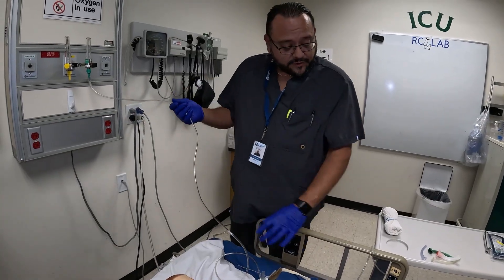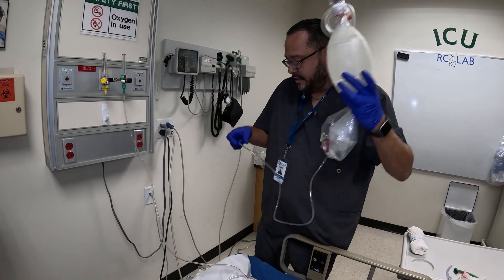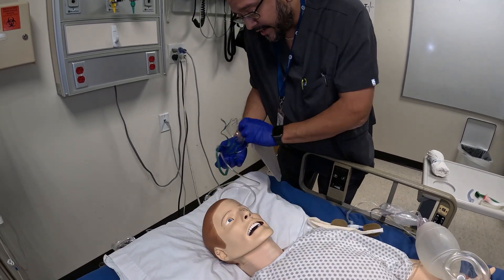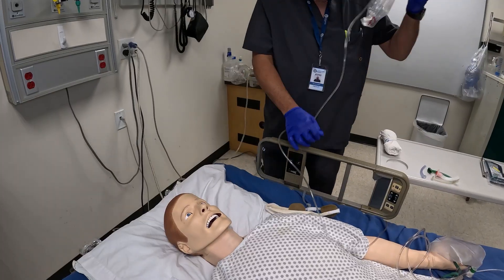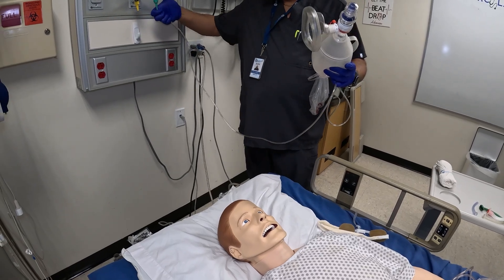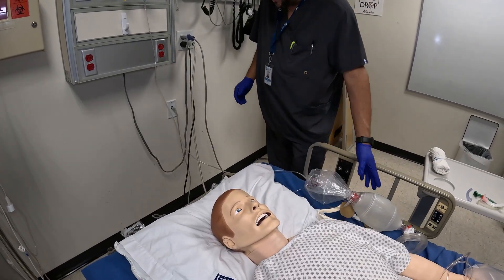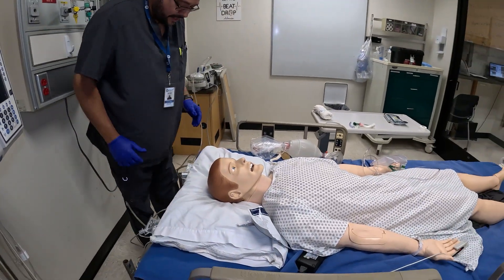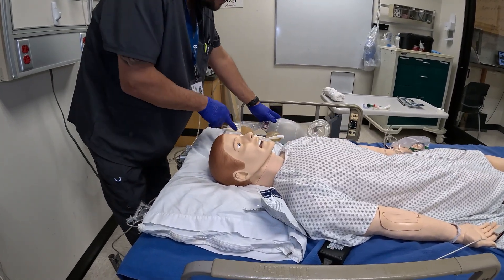I'm going to switch over to my Ambu bag. You want to make sure the patient is on something so they can get all the extra oxygen and hyper-oxygenate. Have your Ambu bag ready so you can give manual breaths if need be, and also to confirm placement once you intubate. This will be on 15 liters — you'll have a good seal with the mask. A lot of times you'll have an assistant with you who can help. For demonstration purposes, I'm going to show everything myself.